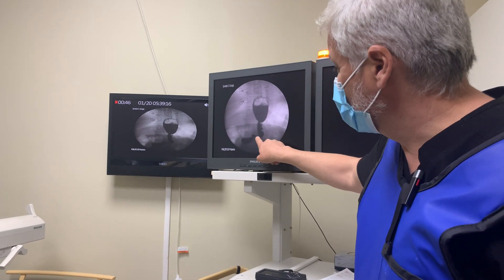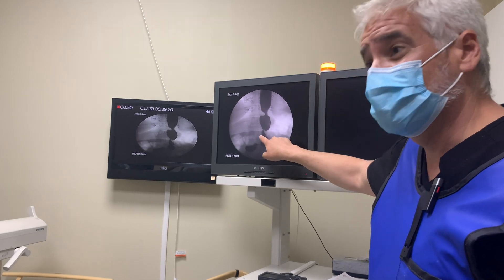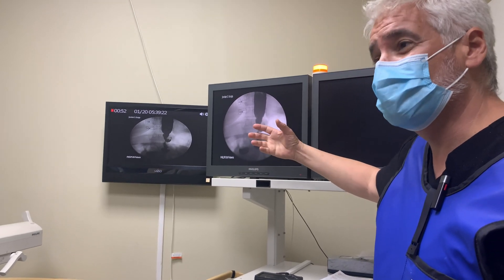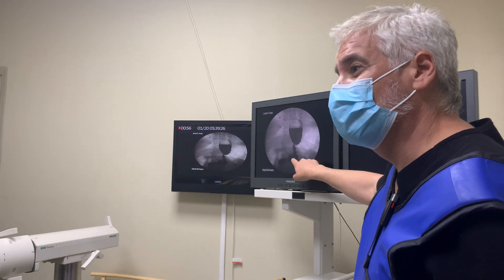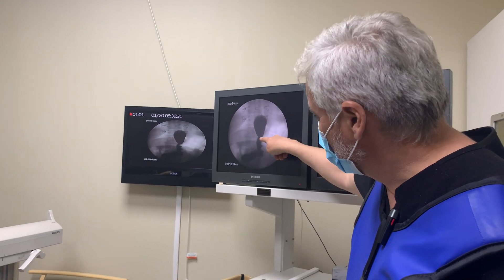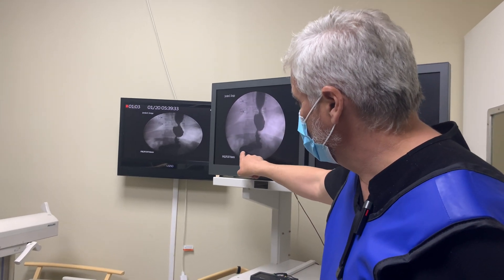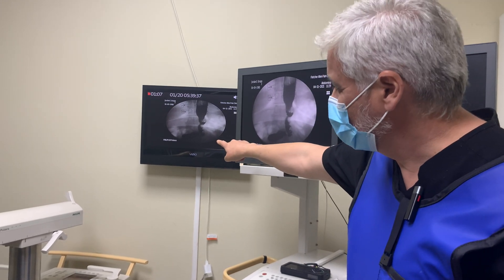We're seeing how the new stomach looks now. This is a small stomach — this is what the new procedure looks like. Your original stomach would hold around 10 times more volume than it does right now. And as it goes down, it's going to slowly go down into the intestine. You can see it better on that screen over there.